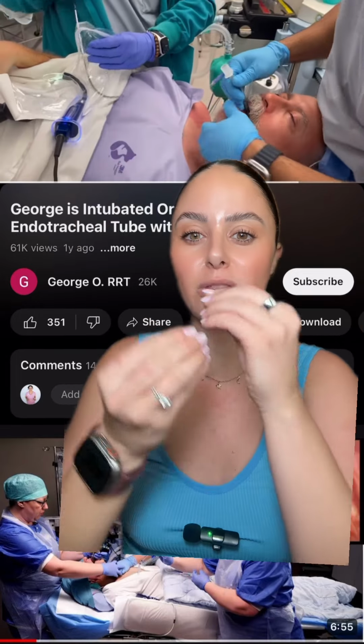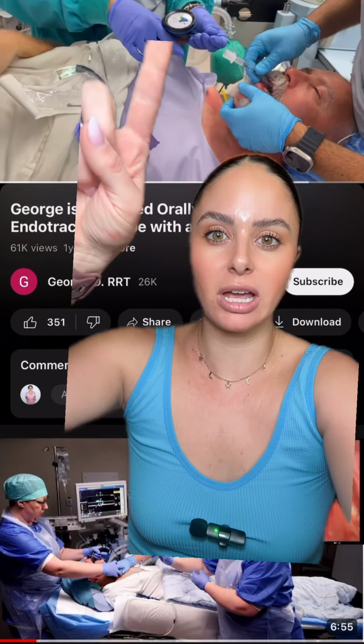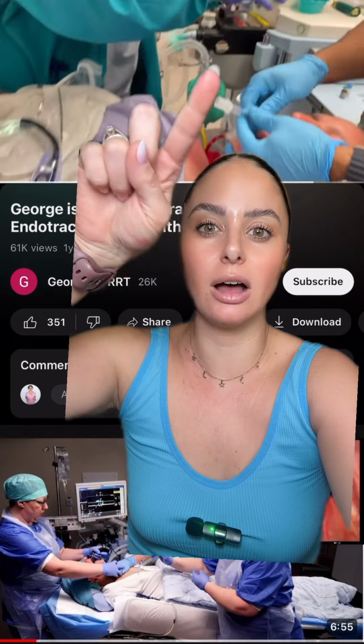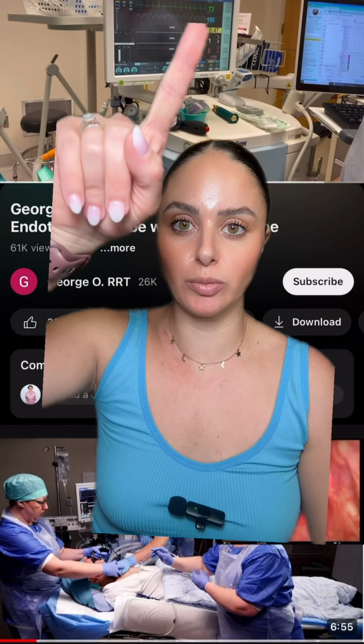The stylet is keeping the firmness of the tube when it's being placed so it doesn't bend all over the place. This person's hooking up a manometer to check the pressure of the pilot balloon. To confirm placement, we usually look at the patient's end tidal CO2, which you'll be able to see on the monitor here in a second. We also look for chest rise and fall. And in the ICU, we like to get a chest x-ray.